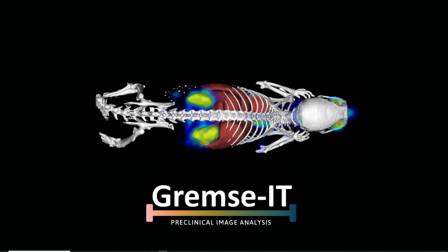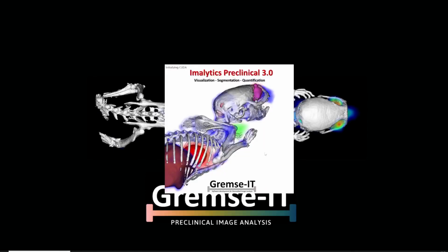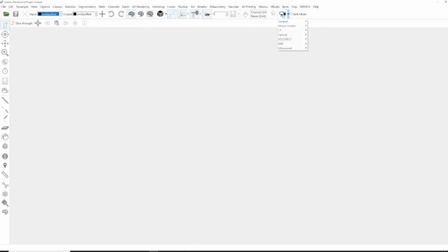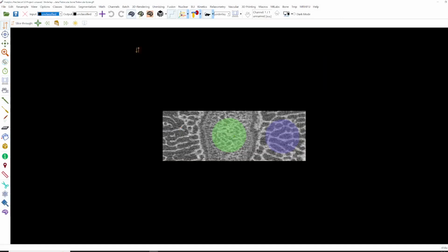Welcome! In this movie I would like to show you how to perform analysis of trabecular bone structures using the Imalytics Preclinical software. Let me open the software first. You can find an example dataset under Tutorials, CT, Trabecular bone, load example dataset.